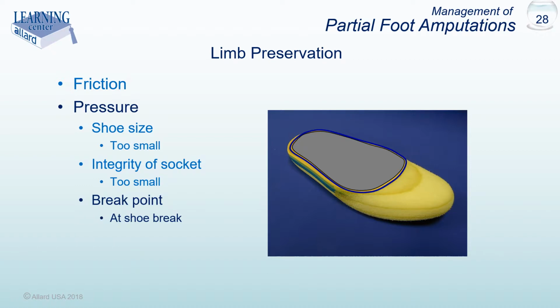If a firm material is used to fabricate the filler prosthesis, it is recommended that a softer durometer breakpoint be added to avoid the filler prosthesis pressing into the socket during the third and fourth rockers. This step can be avoided by using a material for the filler prosthesis that is soft enough to flex, but firm enough to support the shoe and keep it from collapsing.